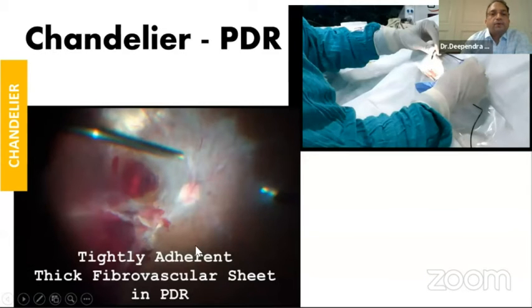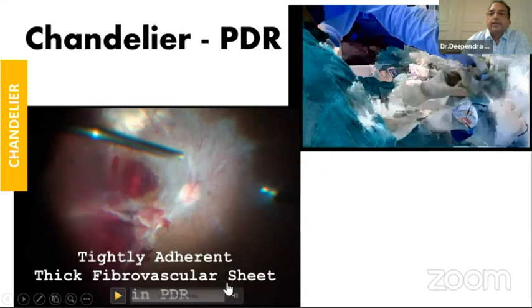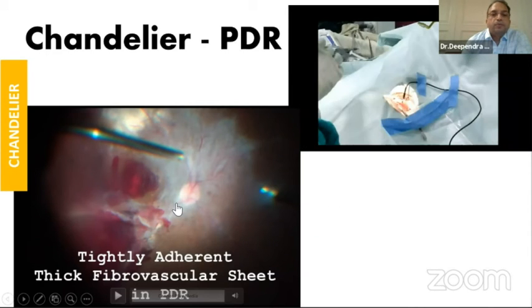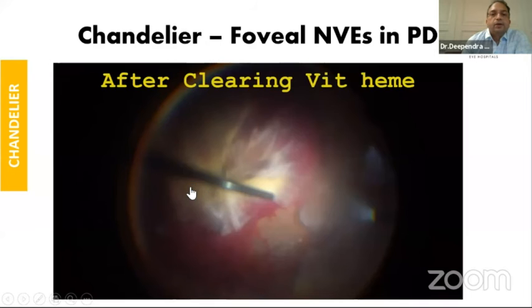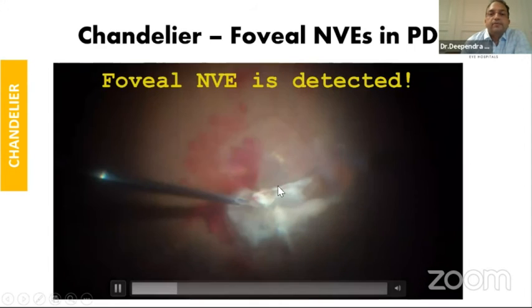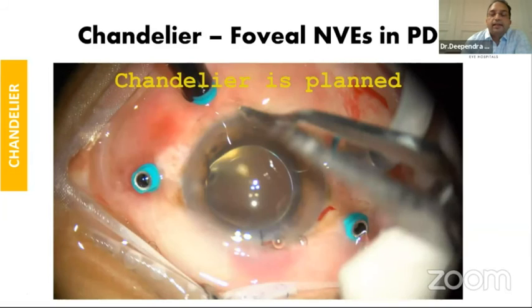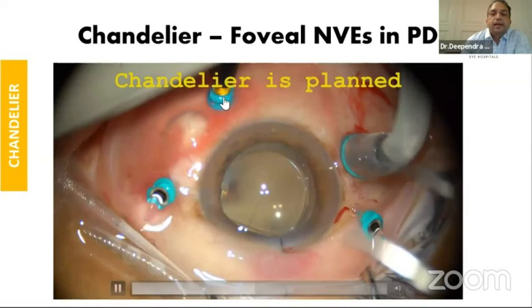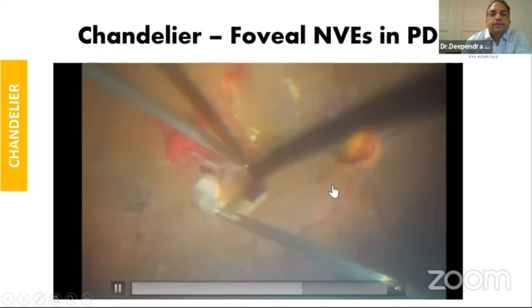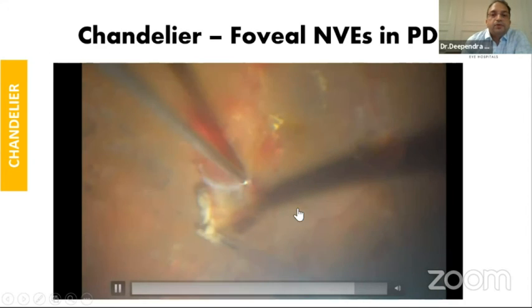Now I'll quickly cover chandelier. Dr. Ajay has already highlighted the topic. The video on top shows how you have to fix it at the start of your surgery so you can get nice illumination. All of us know that for complex diabetic TRDs you will need bimanual dissection and will fix the chandelier. A relatively less known indication is if you encounter foveal neovascularization — to dissect it safely without creating a foveal tear, it's better to fix the chandelier. Plan it so you insert it opposite to the site of pathology. With proper direction, proper bends, and fixed with tape, you will get very nice illumination for bimanual work.